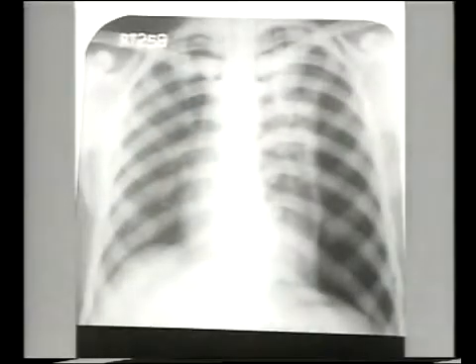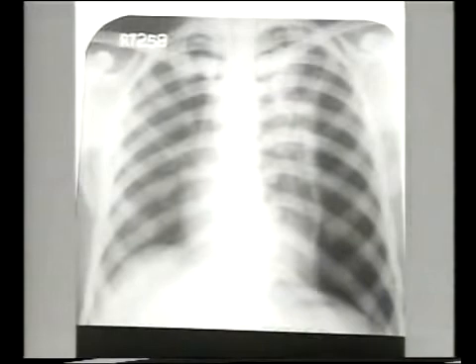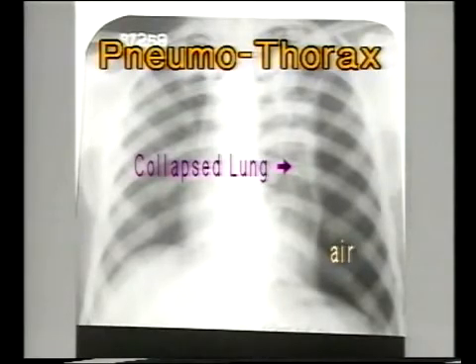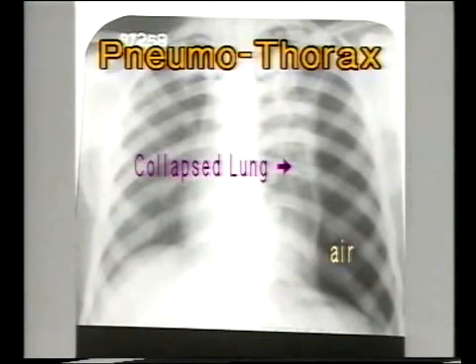In this X-ray, note the peripheral radiolucent area on the left side with no bronchovascular markings. This uniformly black area represents a collection of air in the pleural cavity or pneumothorax. The lung is collapsed and you can see that it is more radio opaque and its border is seen as a thin white line demarcating the collapsed lung.